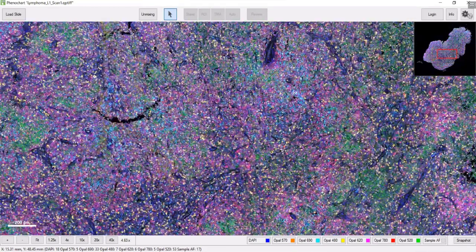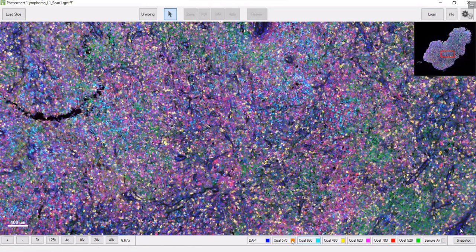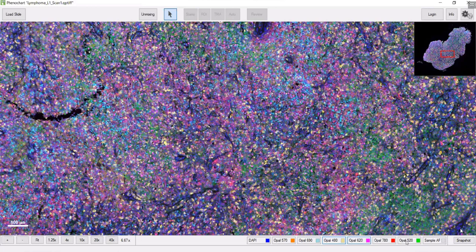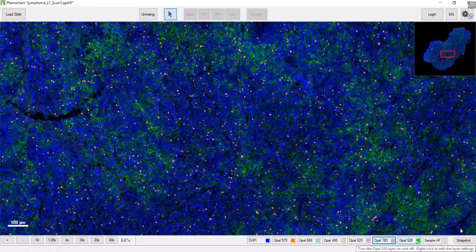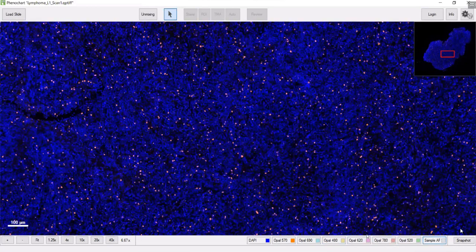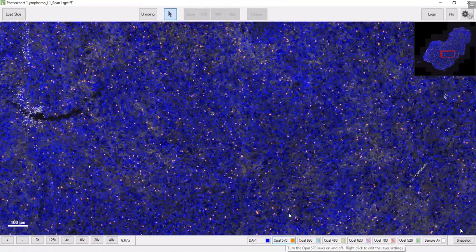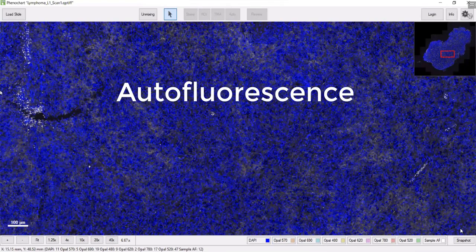This is a lymphoma biopsy. All of this is greatly benefited by getting rid of the autofluorescence signal, which is this right here.